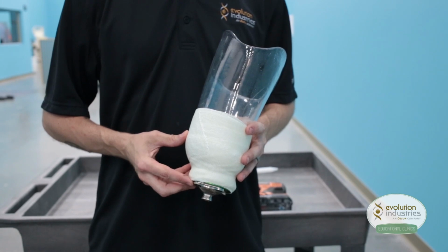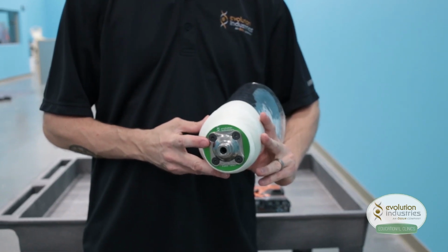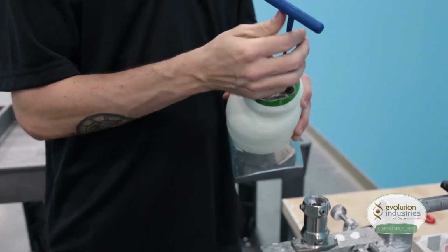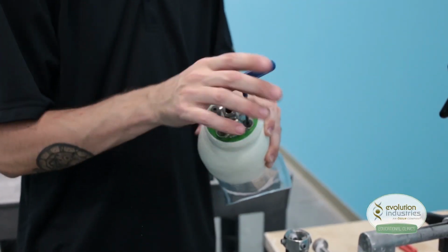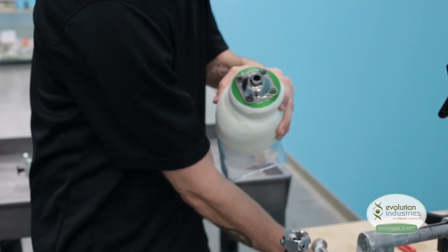The first step in fabricating our definitive socket is preparing our check socket. If you followed the previous video or our valve manual for section 1, your check socket will be mounted on a VMP001 and wrapped in Scotch cast as such. The first thing you want to do is remove the 4 20mm set screws, and we are going to change out the duckbill valve or seal washer and housing and replace it with the dummy.